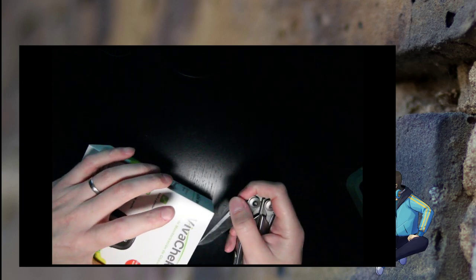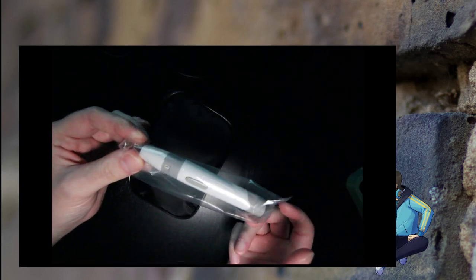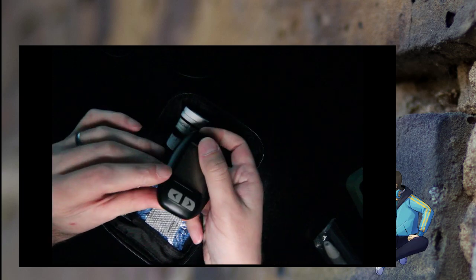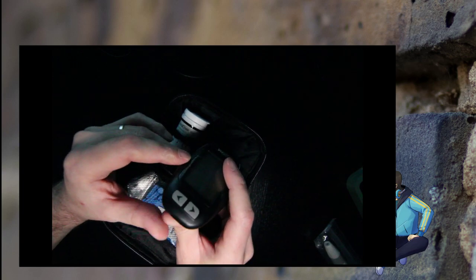So this is technically an unboxing video now. Very standard, comes with a case. Also comes with a lancing device and a bunch of instruction manuals. Probably all go to trash afterwards. This lancing device, I think I have a few that are identical to this one, so I assume this is just made in bulk. The case is not as cheaply made as I've seen others to be. And yeah, this is the device. It does have a micro USB plug. You can probably tell that.